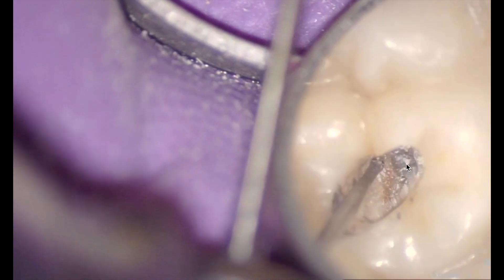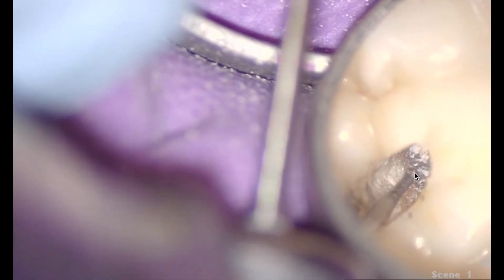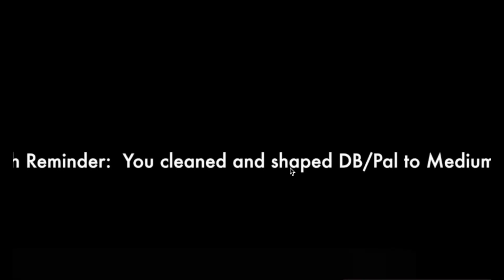These are called Muntz burrs — they're available in the United States, but if you're elsewhere in the world you might not have access to them, so let me know if you'd be interested. What I'm doing is just literally removing that calcification, that pulp stone, with a nice brushing technique.